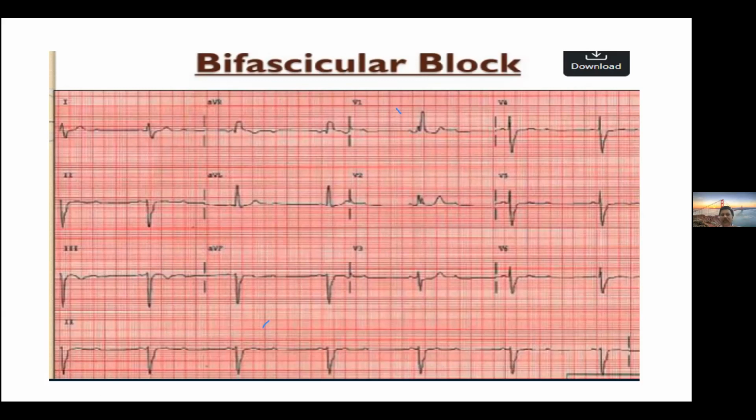In acute MI with a bifascicular block, the patient is possibly going into impending complete heart block, and we need to treat them urgently. So the summary of whatever I told: right bundle branch block is most of the time benign. Sometimes it can happen, especially in anterior MI. You have to treat it very, very quickly because it is a life-threatening situation.